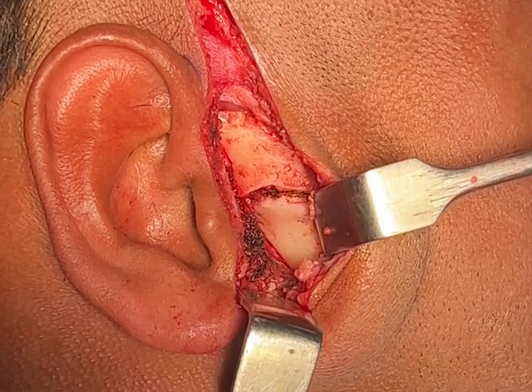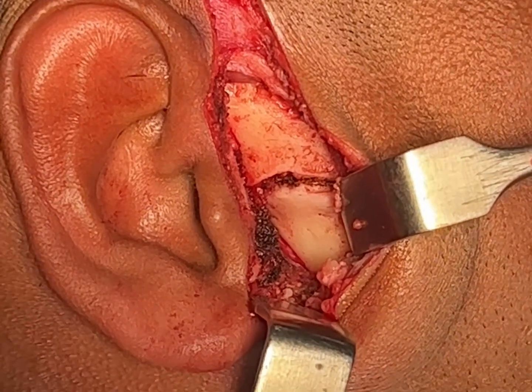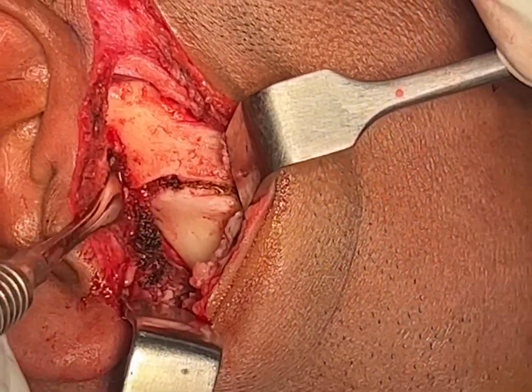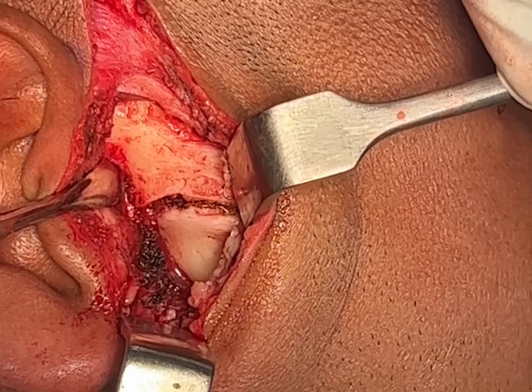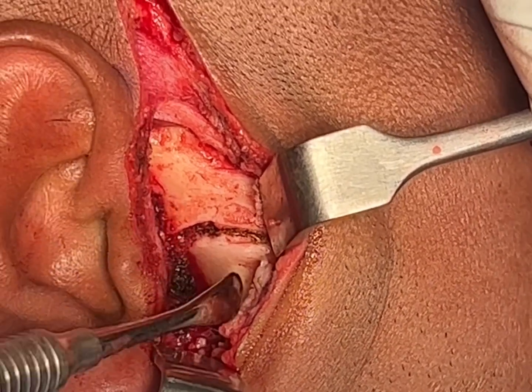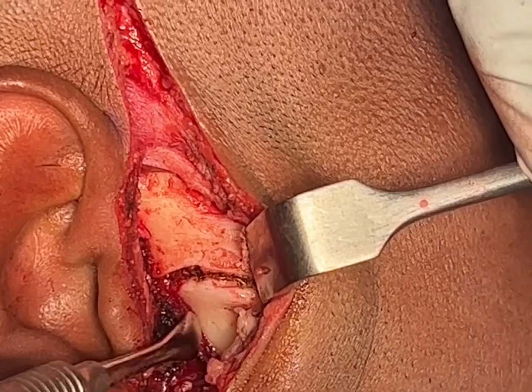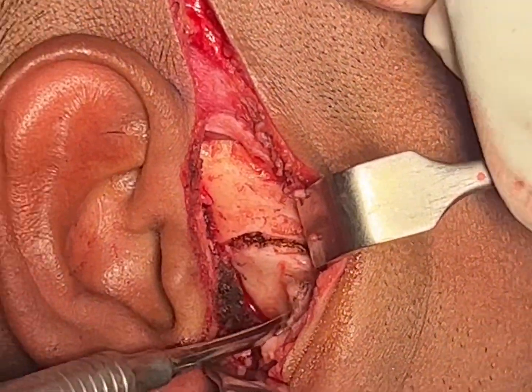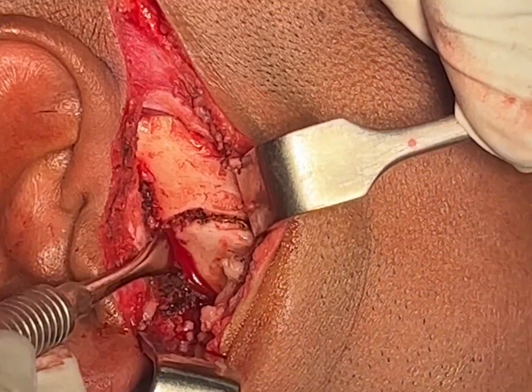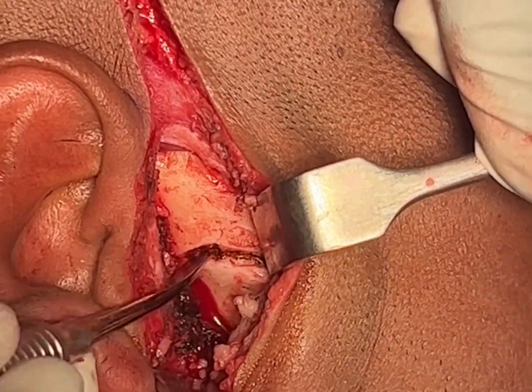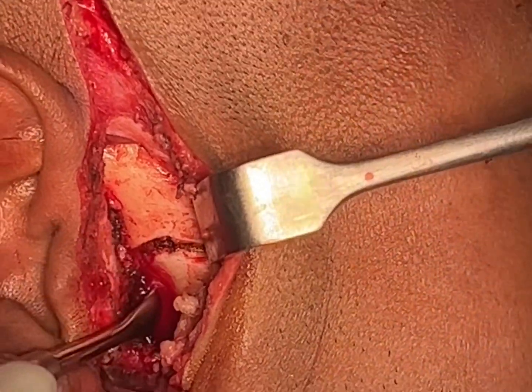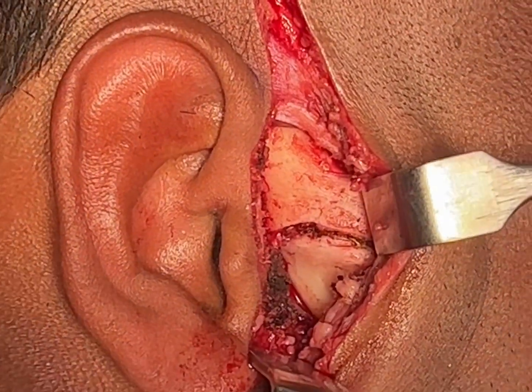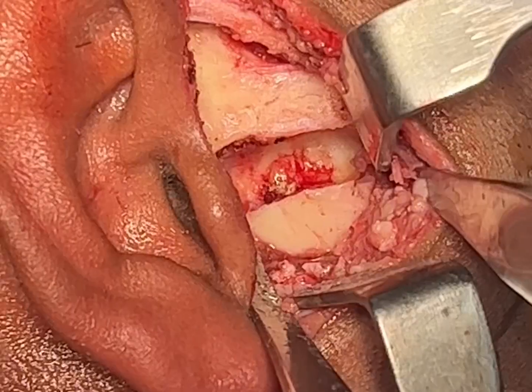What you're seeing is an open fused temporomandibular joint ankylotic mass. This is the zygomatic arch, which is a normal structure — we're not going to be removing this. What you see here is the ankylotic mass; it's fused above with the arch. This should have been the condyle for the patient, but there's no gap — it's totally fused. We're going to be releasing this part of the ankylotic mass and creating a pseudo joint.